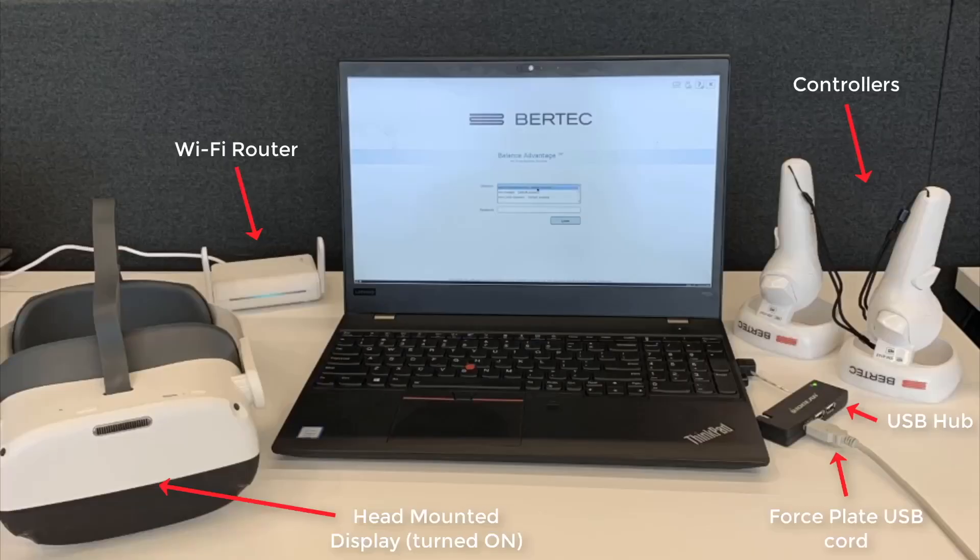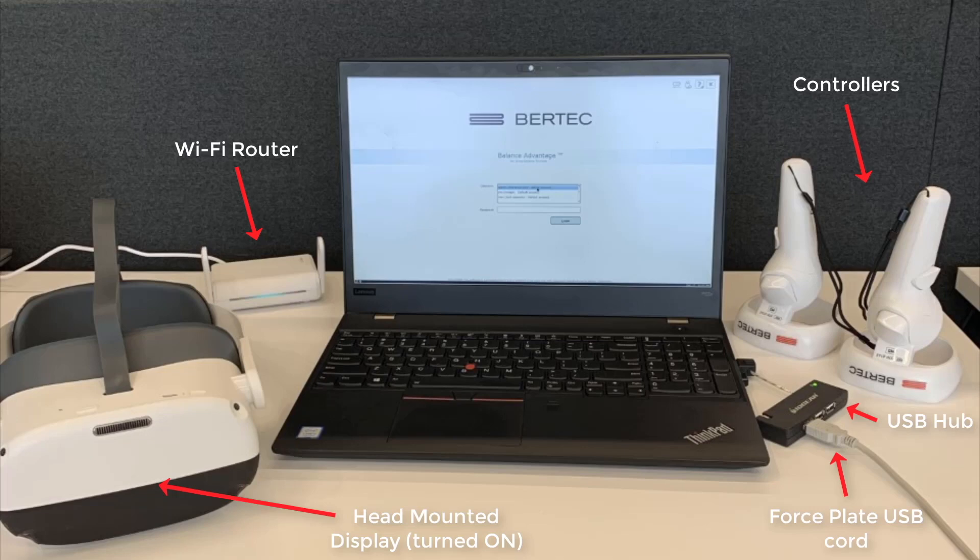Make sure you have all the components shown above. Plug the Wi-Fi router into a wall outlet and place the ears of the router in an upper position.